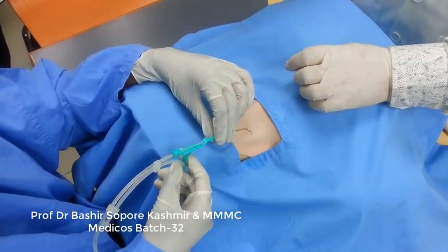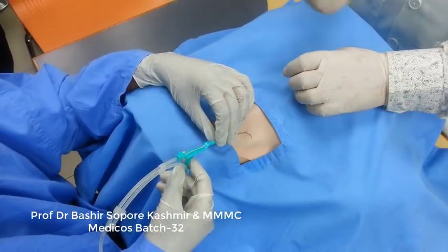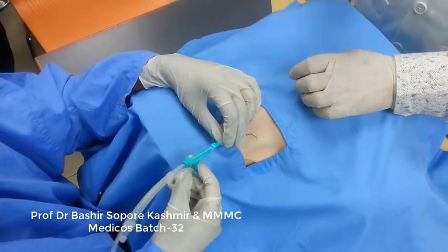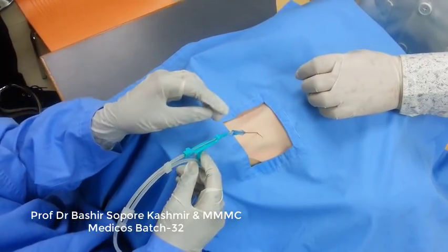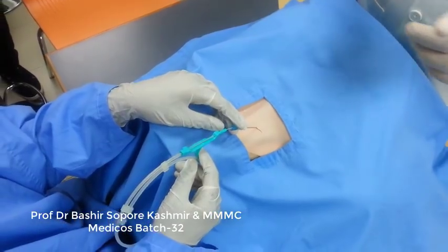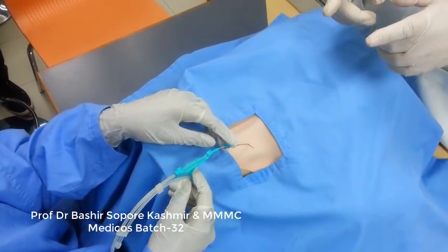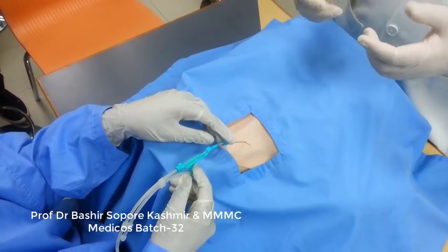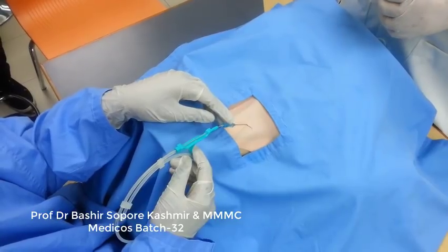Our purpose is only that it should remain in the internal jugular vein, at the end of the superior vena cava. So the length up to that is around 12 centimeters. That is why some books write 12 to 14 centimeters, and it is also written that it is safer to keep it at 12 centimeters. You got my point?